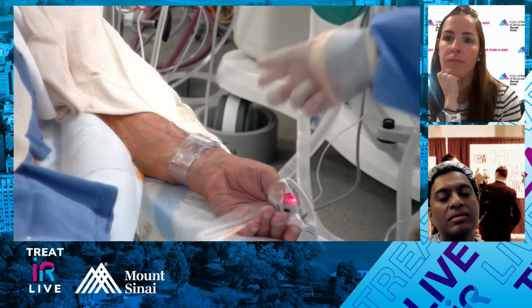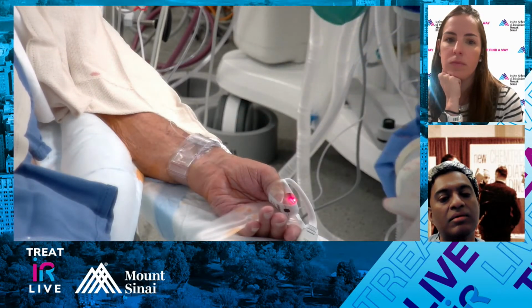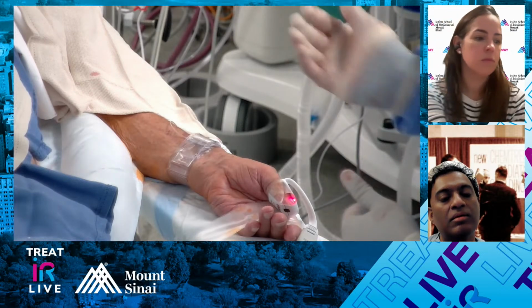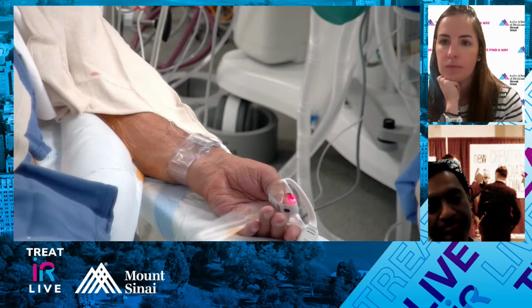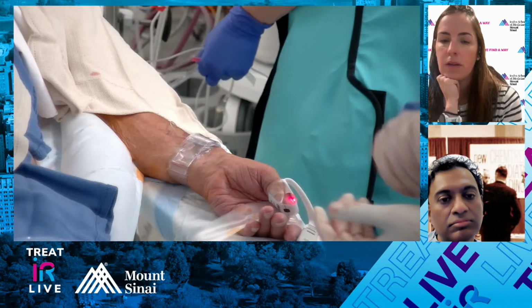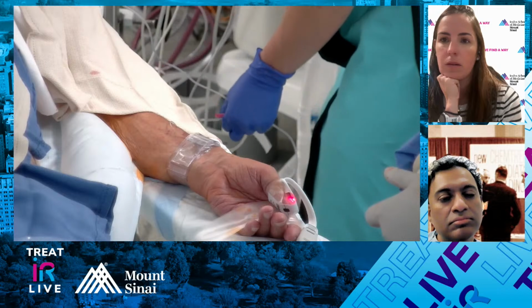So technically speaking, it's actually upside down because it's designed for right radial. So it makes it a little bit hard, because there's a window to see into the spot where it's bleeding. It's opposite of where it should be if it were doing a left radial. So it's on the right side if you're doing it on a right radial approach, but it's fine. We've been using this for a long time. There are other ones that have a ratchet mechanism that you sort of screw down. So there are different ways of doing it.